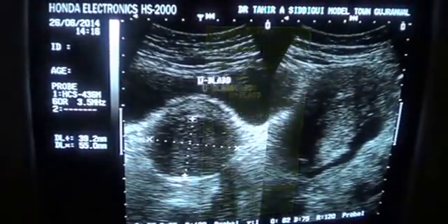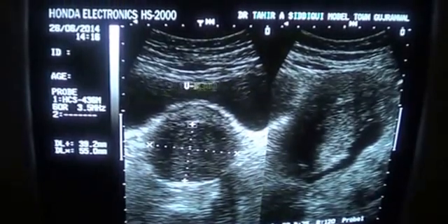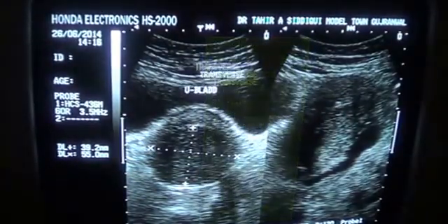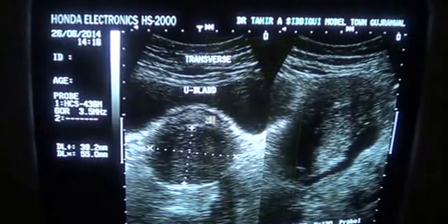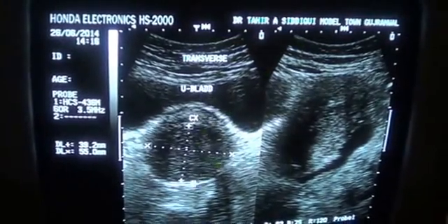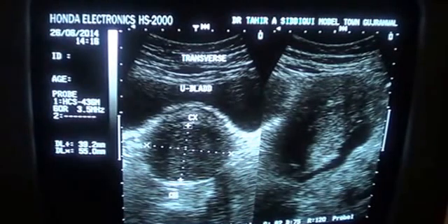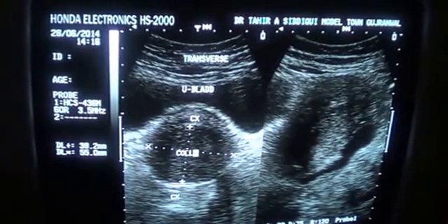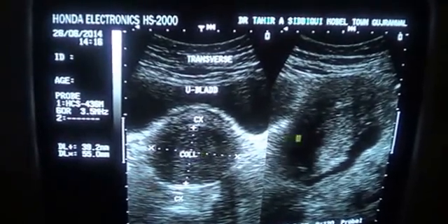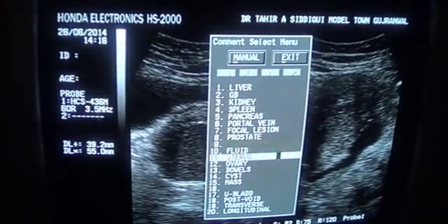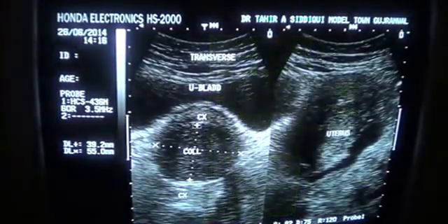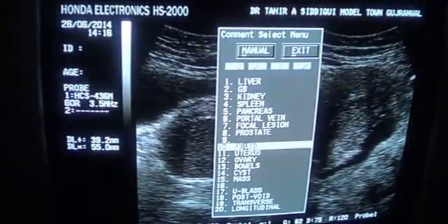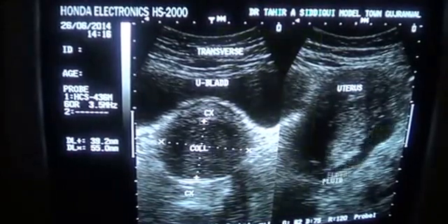This is the transverse section — this is the urinary bladder. Now this is the uterus from a different angle. This is all uterus, and this is the fluid that you can see in the pelvic cavity — a small amount of fluid is seen.